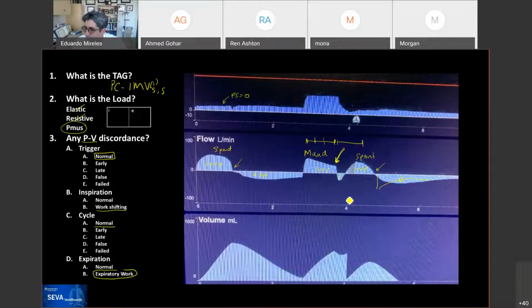Ariel Garnero asks, do you think that the small expiratory flow is caused by the circuit decompression and not by the patient? It could be. Sometimes, as the load goes and the breath ends, you can have a small expiration, but the patient is doing inspiratory effort at that time, and it just hides it. So good point.